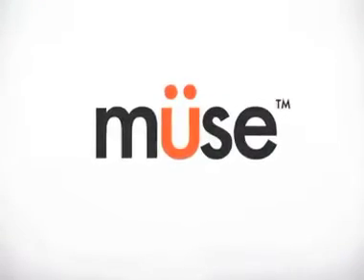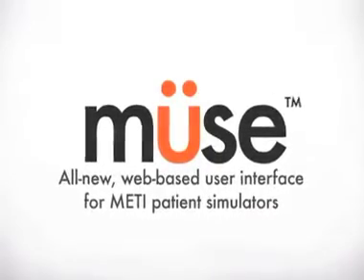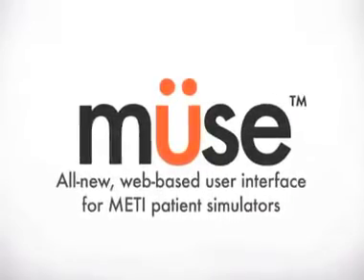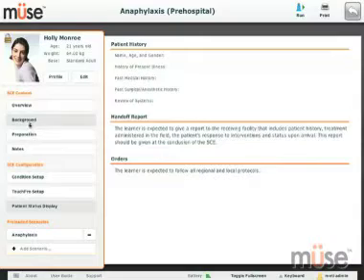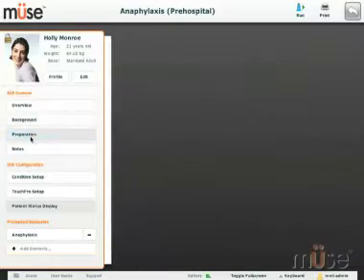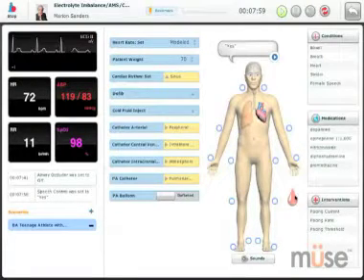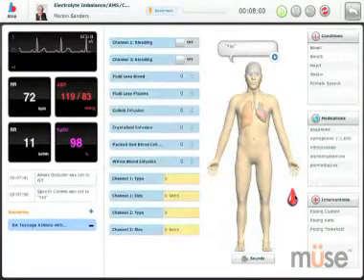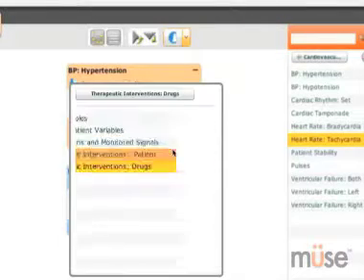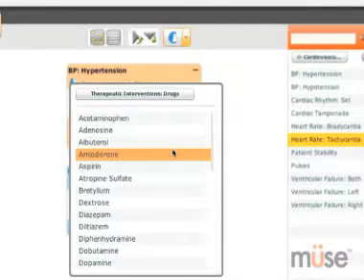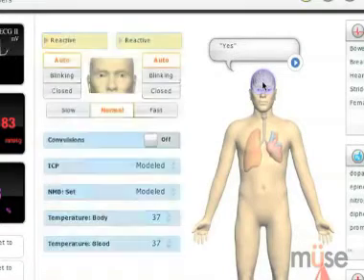Welcome to MUSE, the all-new web-based user interface for METI patient simulators. MUSE makes everything about running a METI simulator easier, faster and friendlier, from the eye-catching design, drag-and-drop functionality and intuitive organization, to a simple interface that keeps essentials at your fingertips.